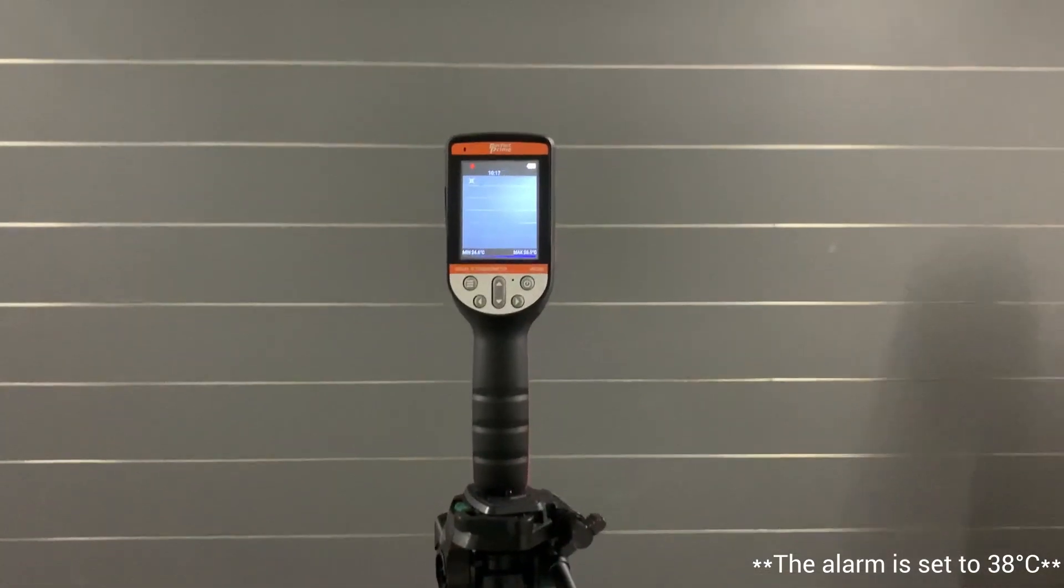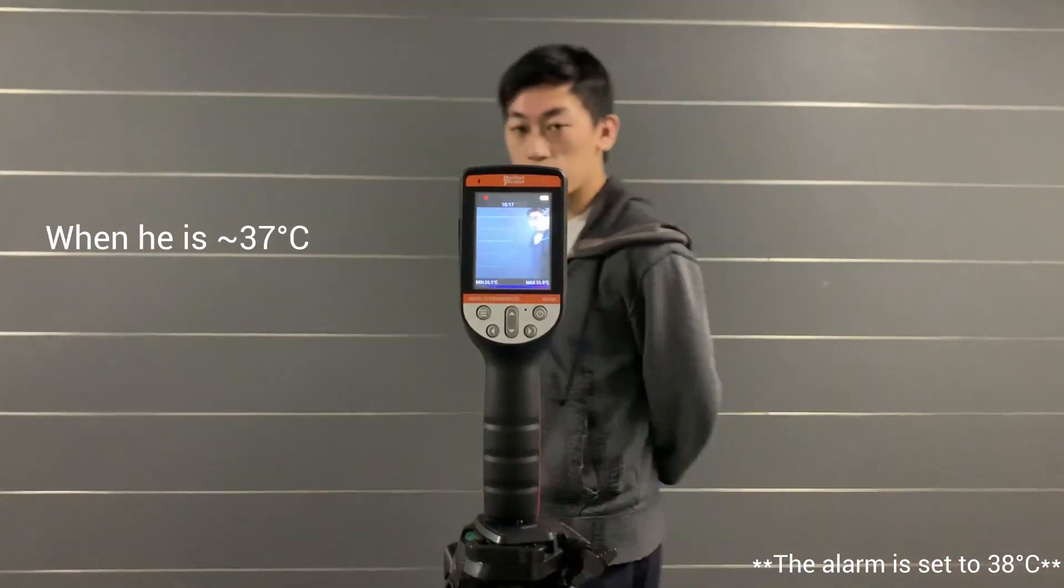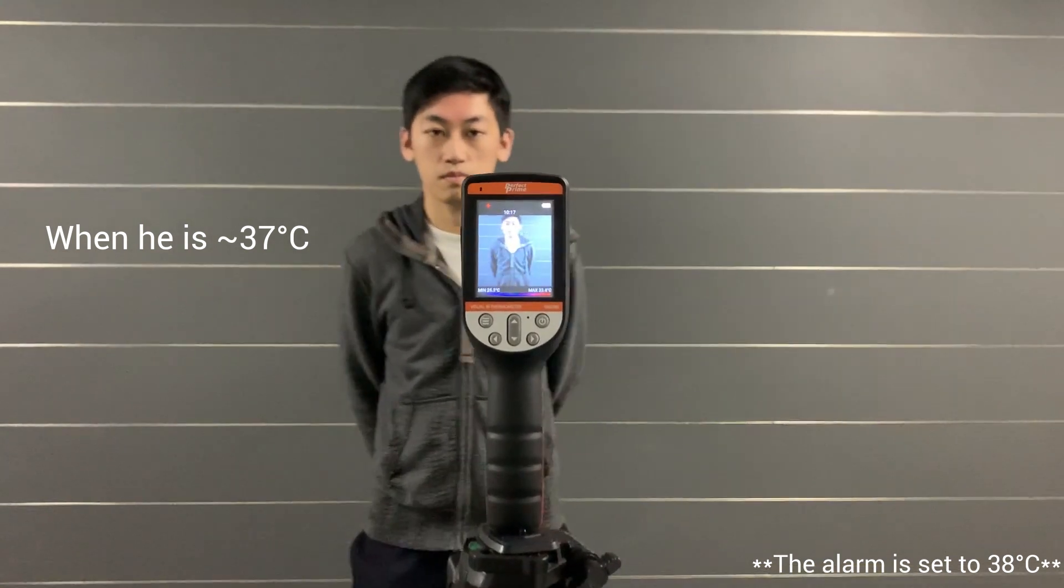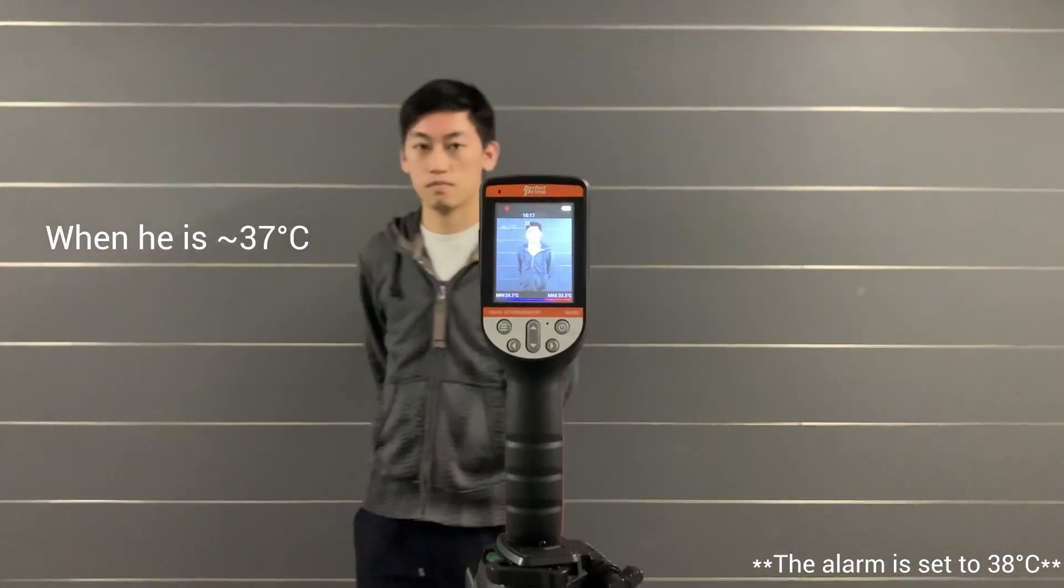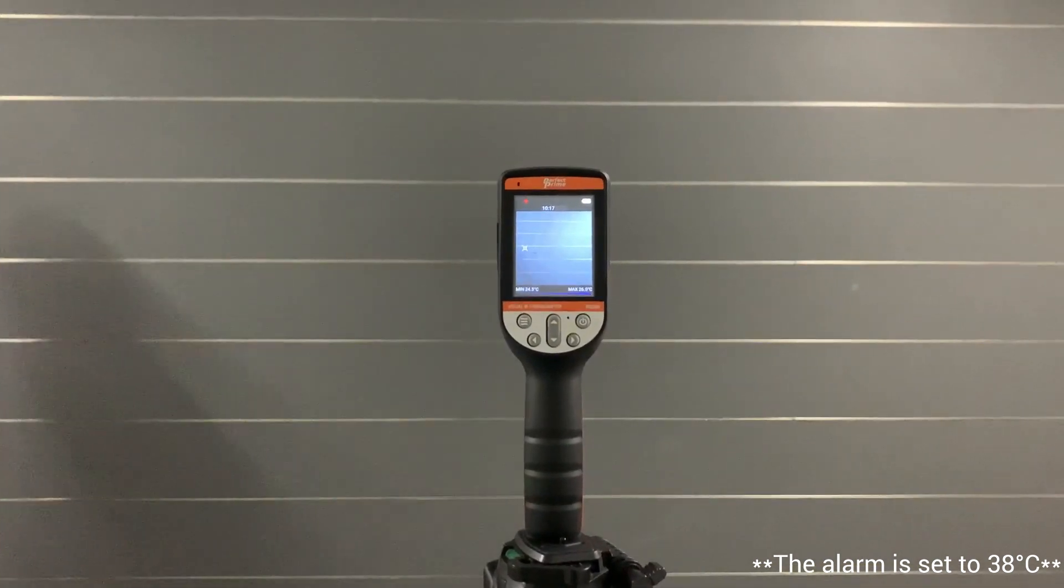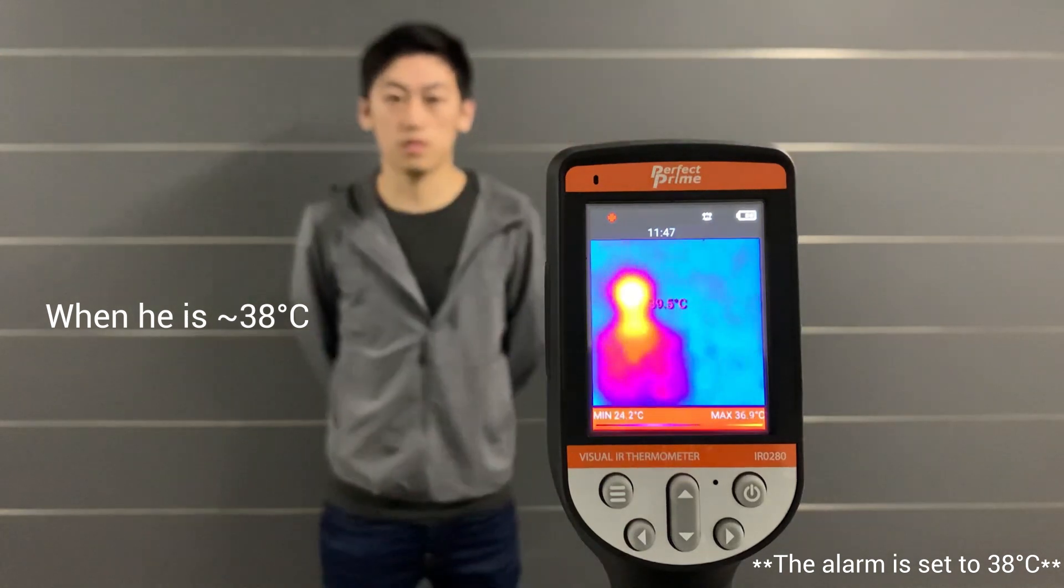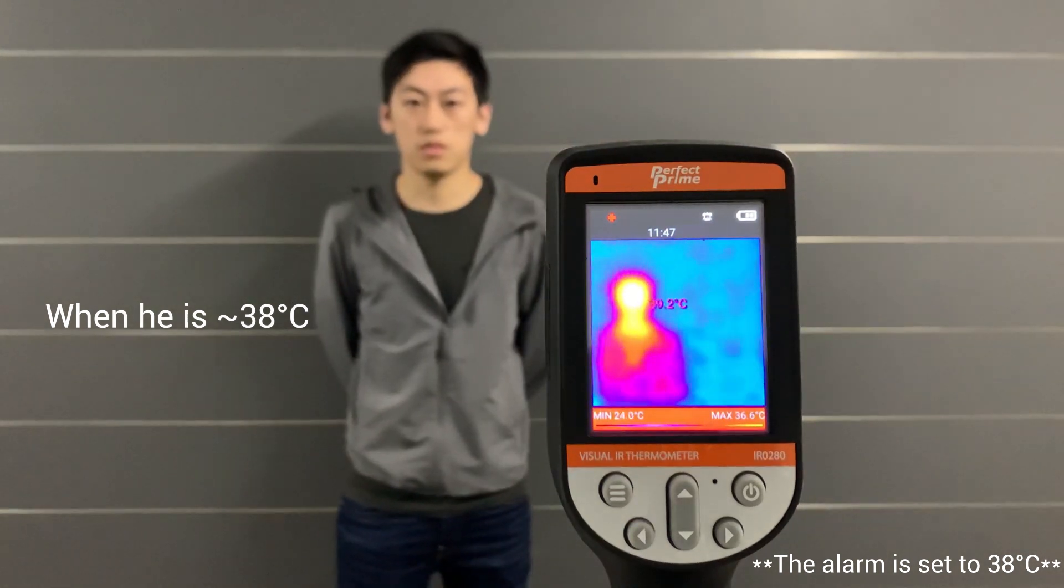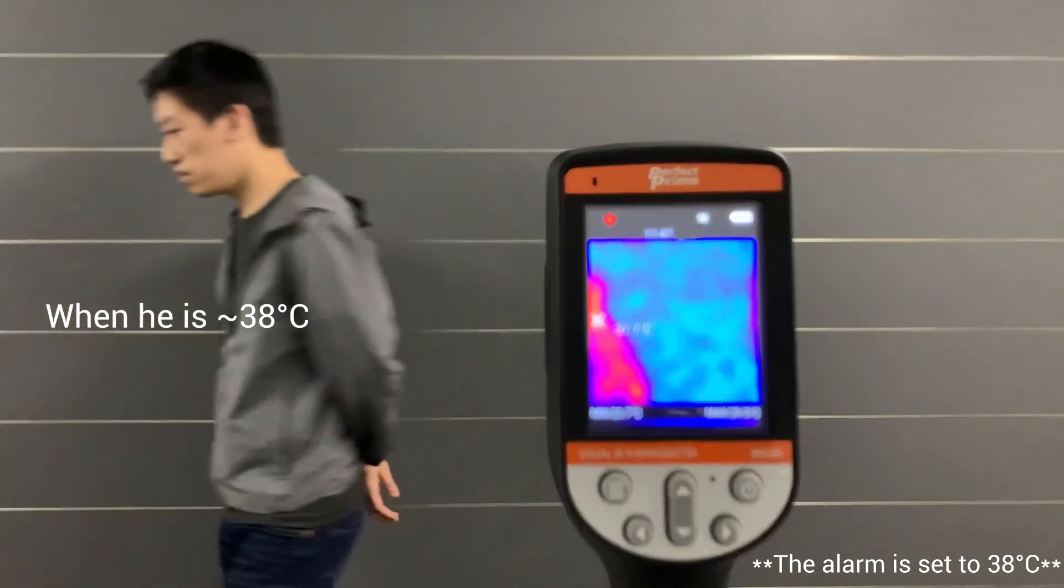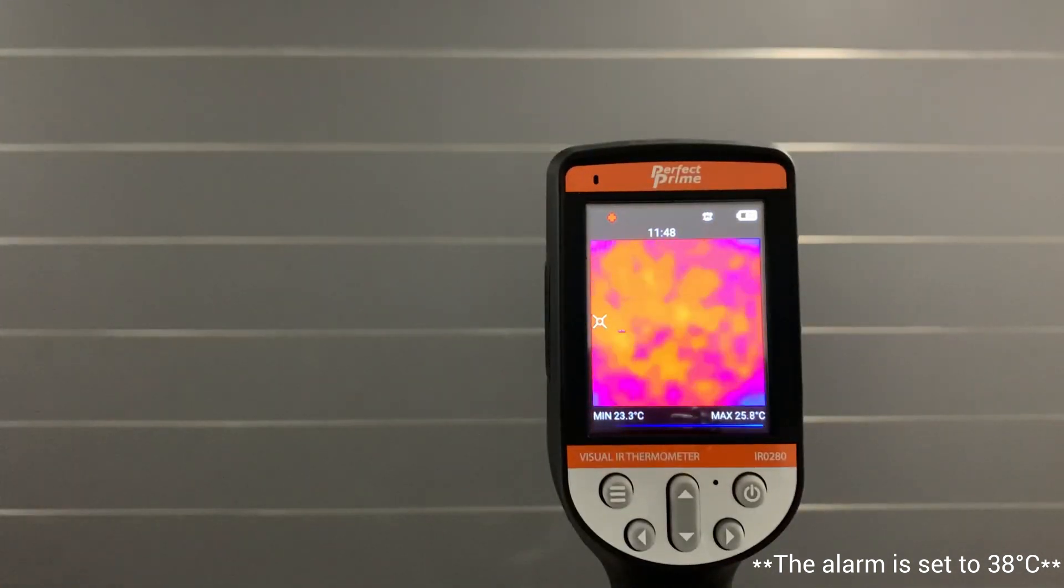The IR0280H has an over-temperature alarm feature which is adjustable. Once set, any temperatures above it will immediately sound the alarm. Take a look at this example where we raise the temperature of an individual.